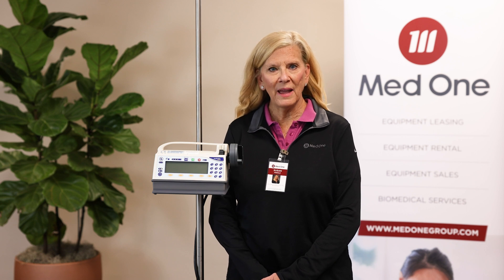Hello, my name is Susan Mingle. I'm the Clinical Nurse Educator for MedOne Group and I'm here today to do a demonstration on the ICU Medical MedFusion Syringe Pump Model 4000.